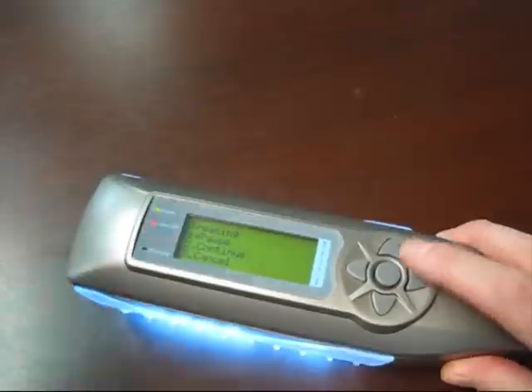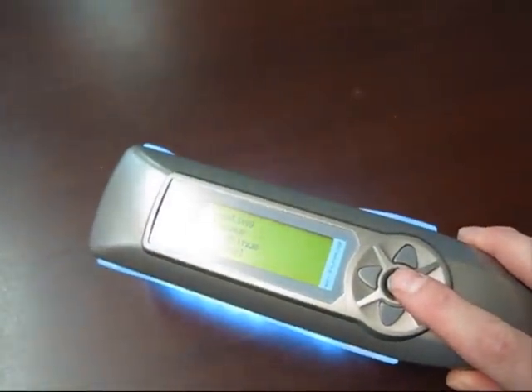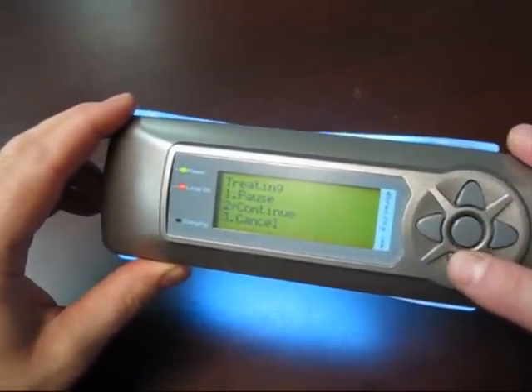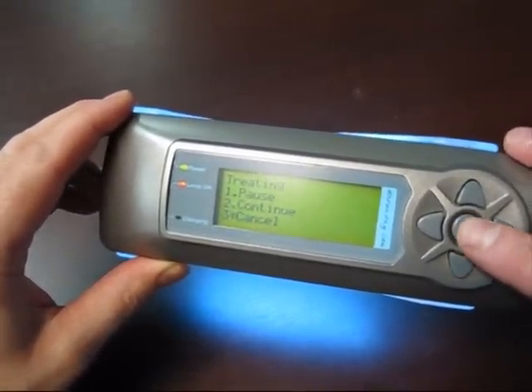Then you can either, one, pause, which will pause the timer, two, continue, and three, cancel. We want to cancel to turn it off.